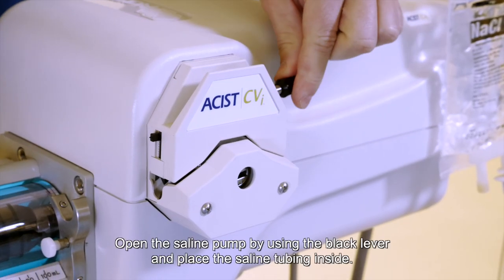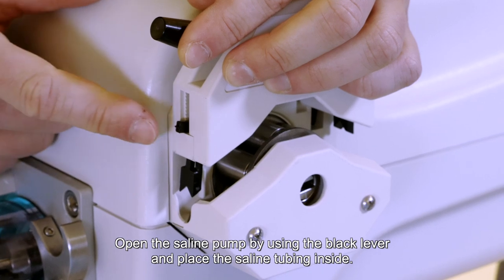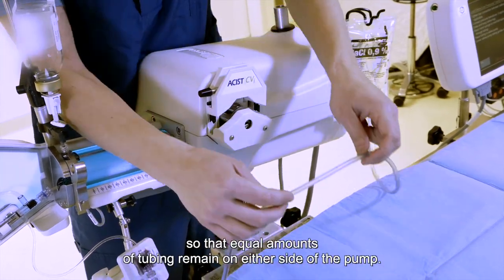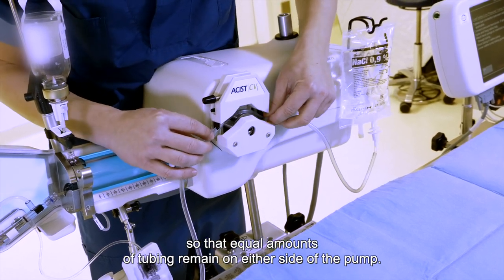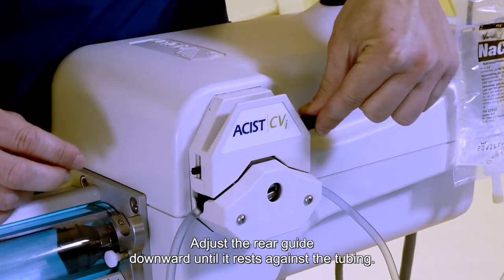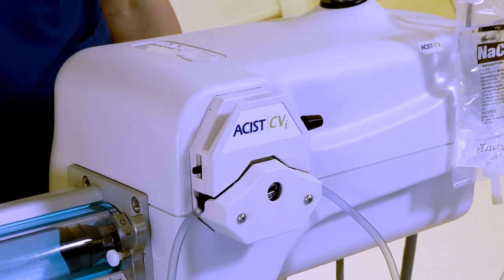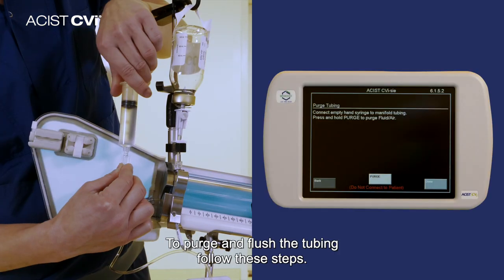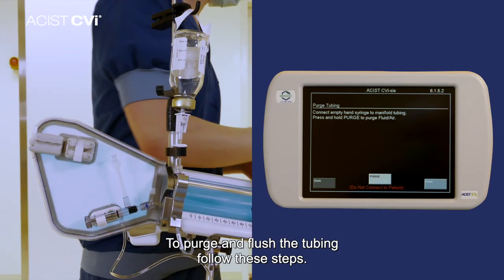Step 4. Open the saline pump by using the black lever and place the saline tubing inside. Next, center the tubing in the pump so that equal amounts of tubing remain on either side of the pump. Close the pump latch, and adjust the rear guide downward until it rests against the tubing. Press Done.